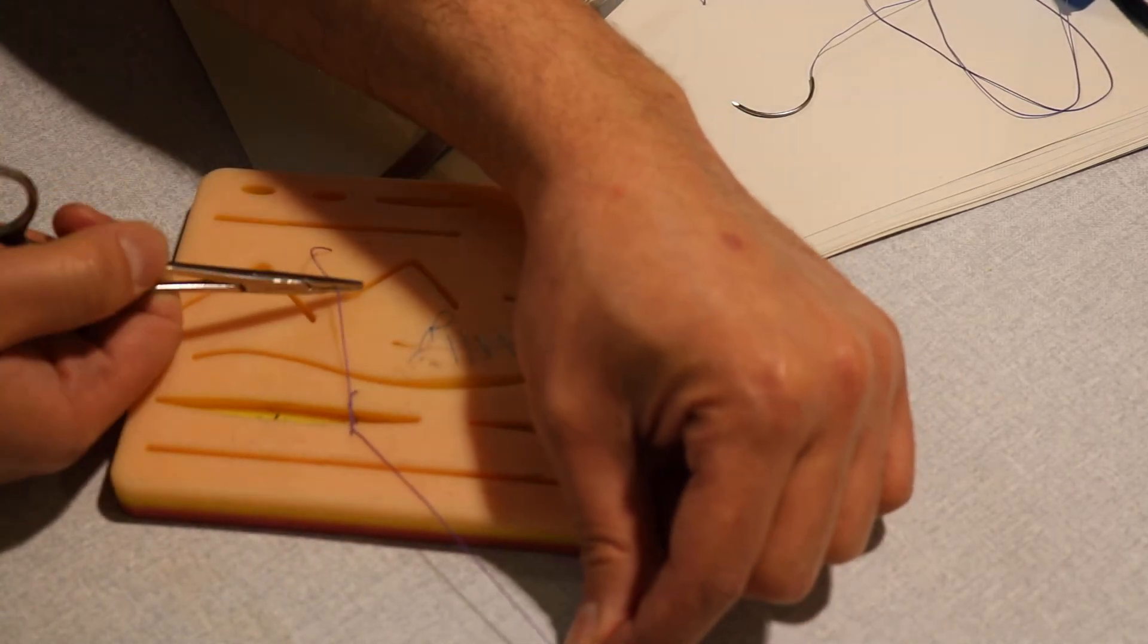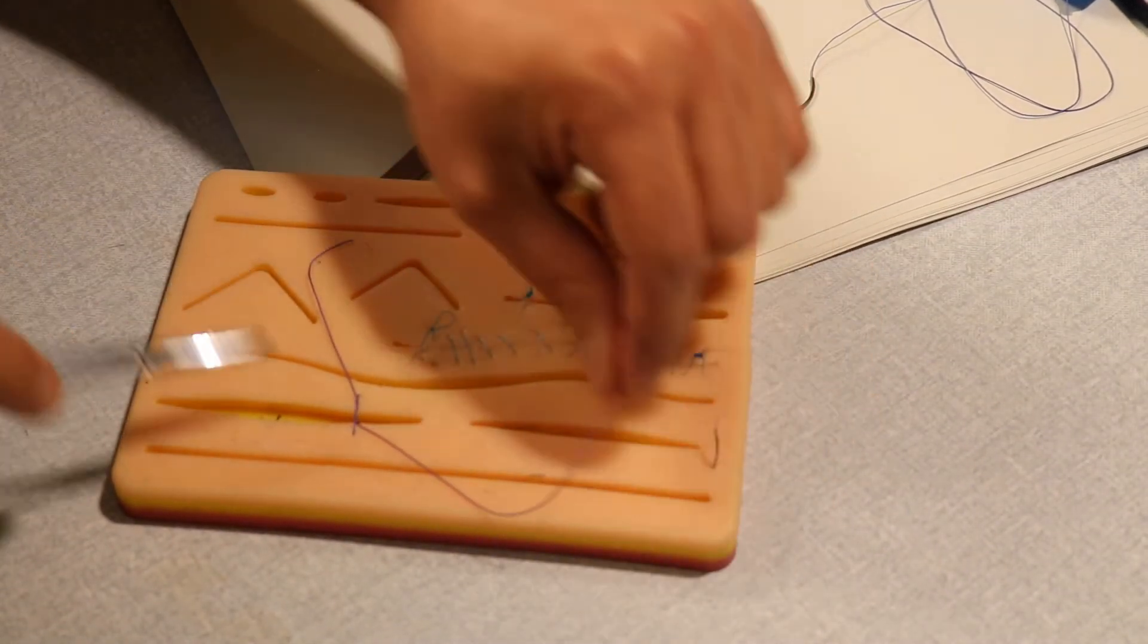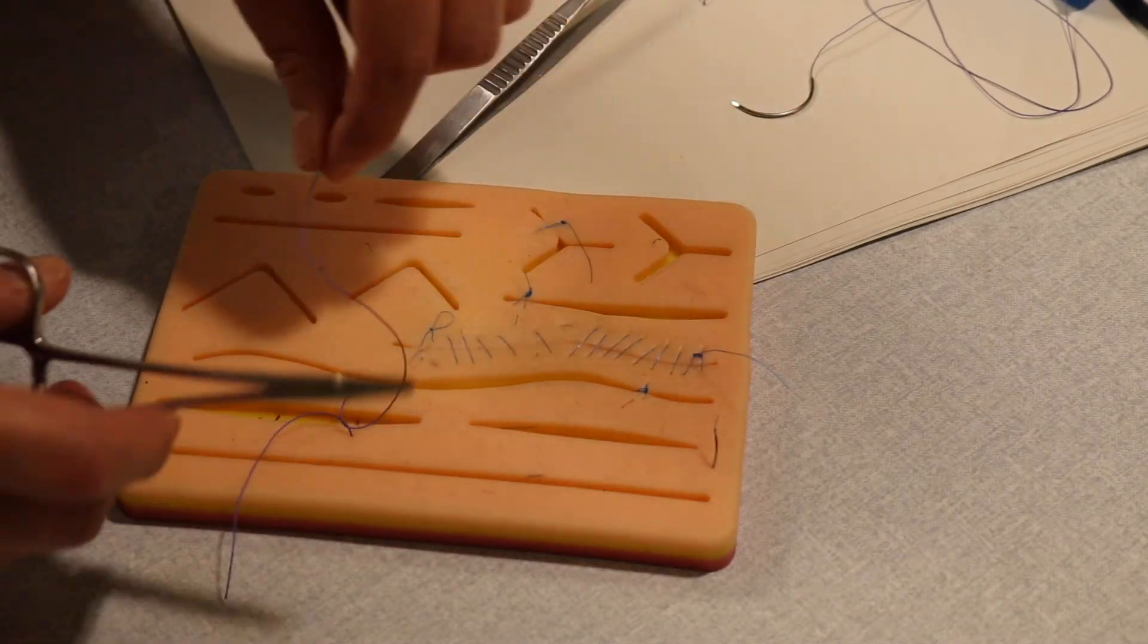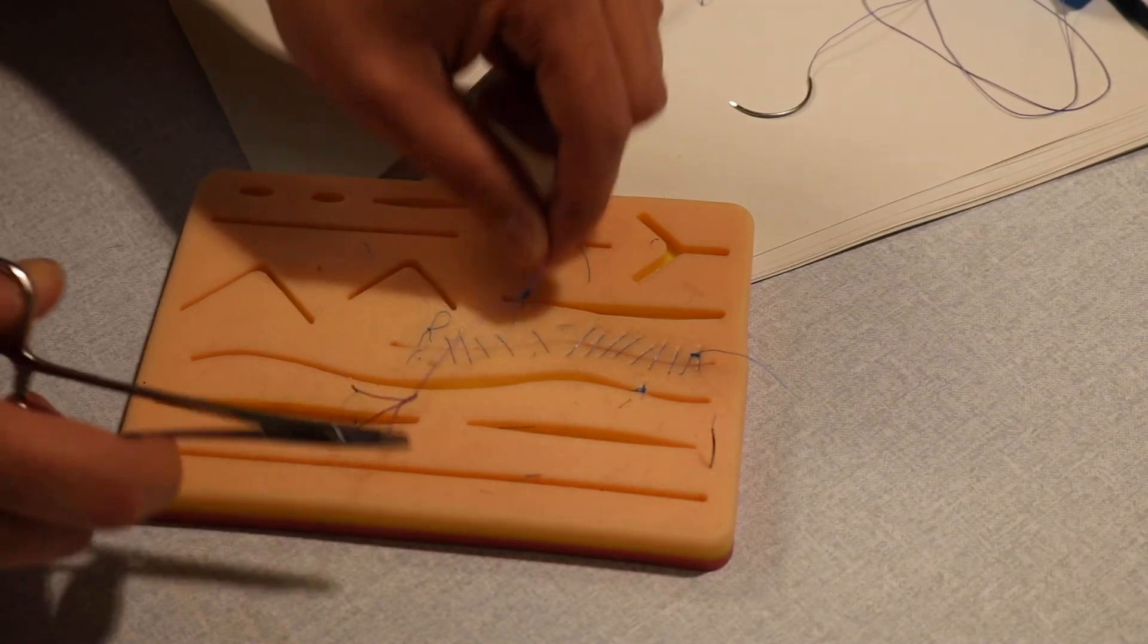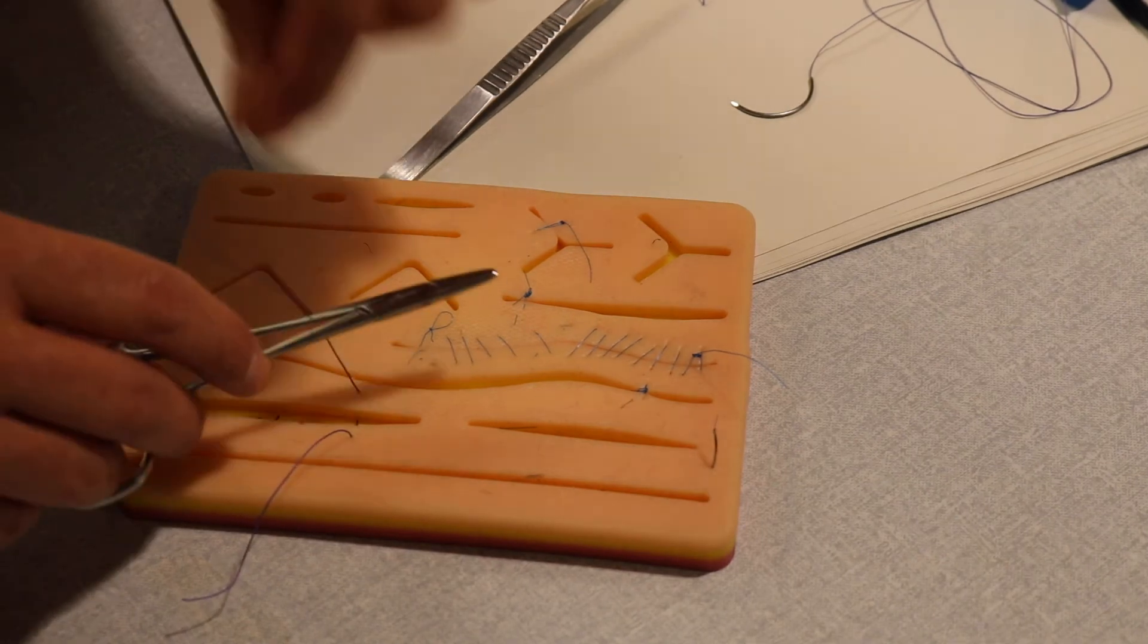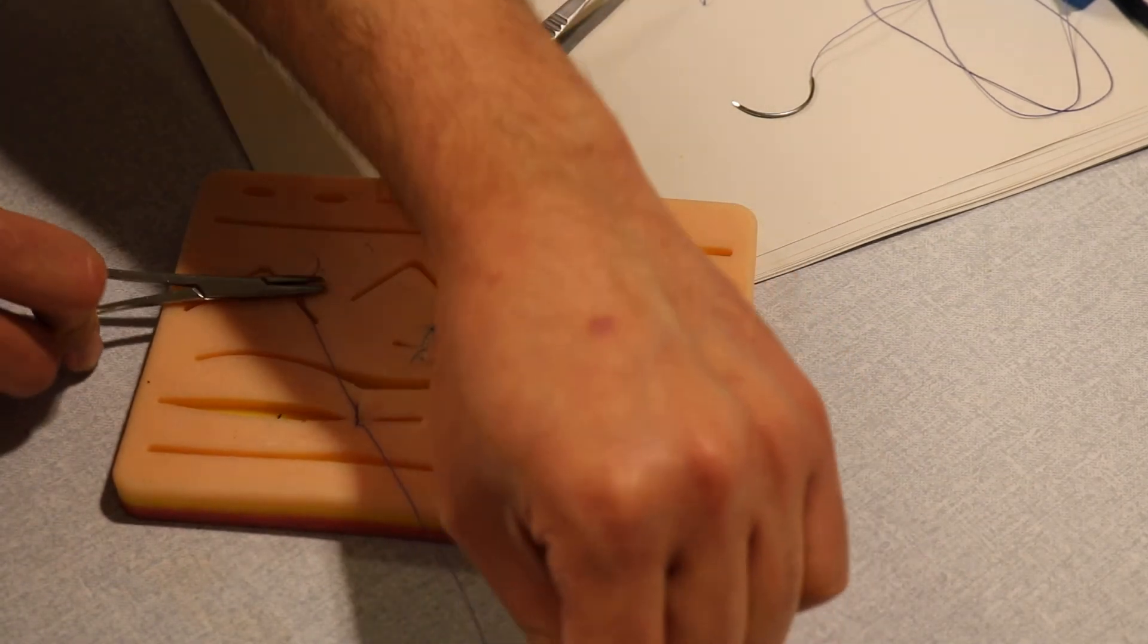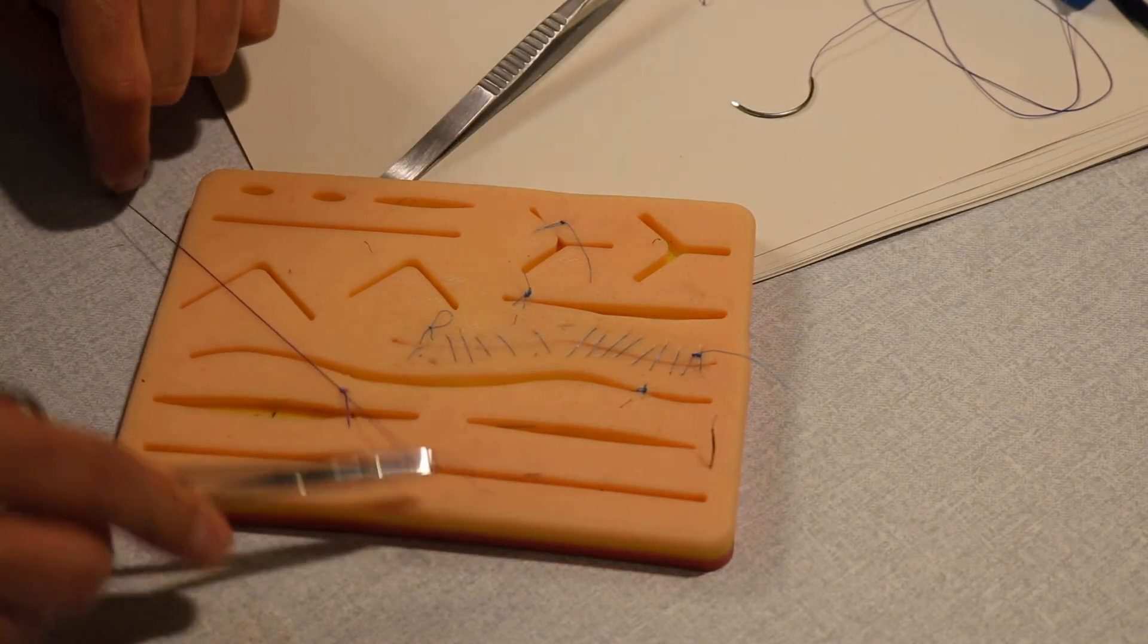The other thing is to do a slip knot, which is leave it like here and do the same, but that's not very recommended really. So in order for it not to slip, you can do two loops, and when you complete it with another reef, now it will be called a surgeon's knot. It will be very secure now.